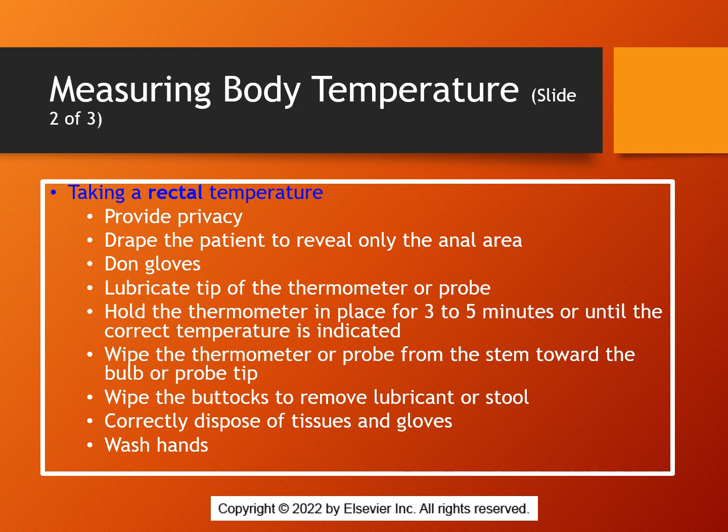Wipe the buttocks to remove any extra lubricant, and dispose of everything and wash your hands.